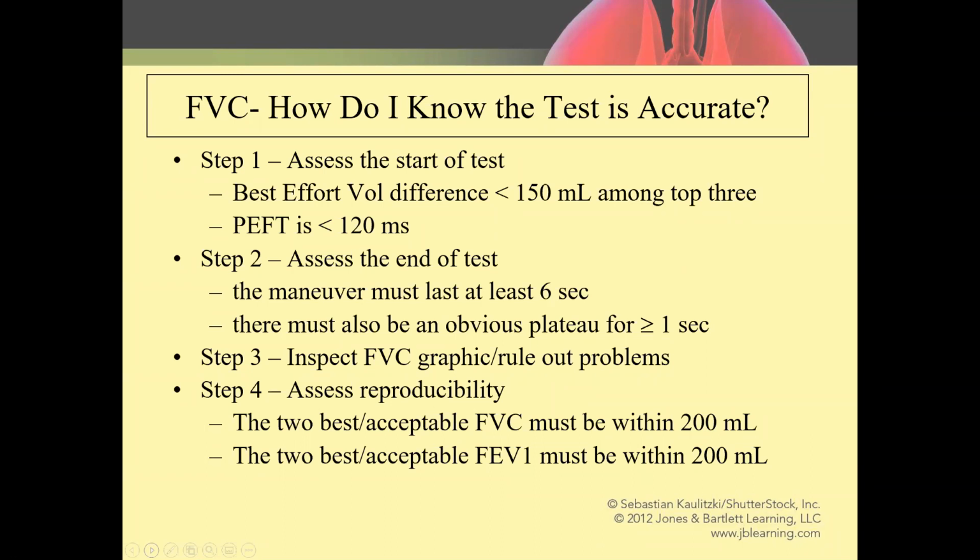Again, there's much more elaboration on this, and a lot of the handheld digital devices that are commonly used today will tell the tester whether it is an acceptable maneuver or not. It may grade it from A through E, but many times it'll be dichotomous, acceptable or not acceptable.